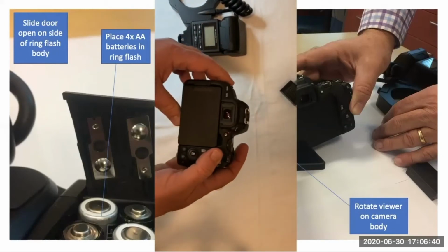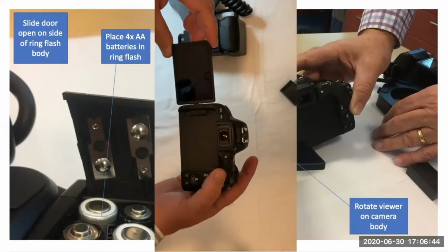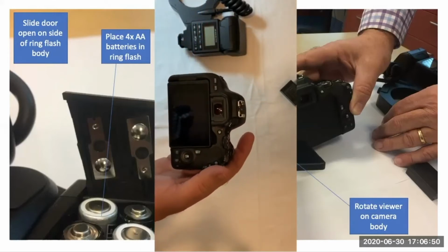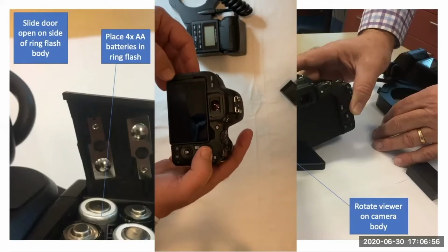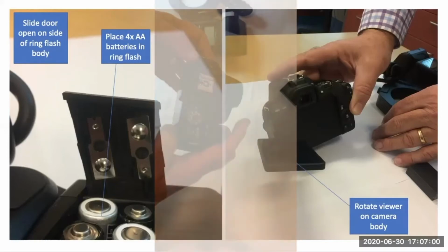The second thing I do is to turn around and change this, because I never use the back of the lens like that. Turn it around and always have it so that it's looking at you, and you can stay like that. These are really strong cameras, so you could just leave it like that all the time.